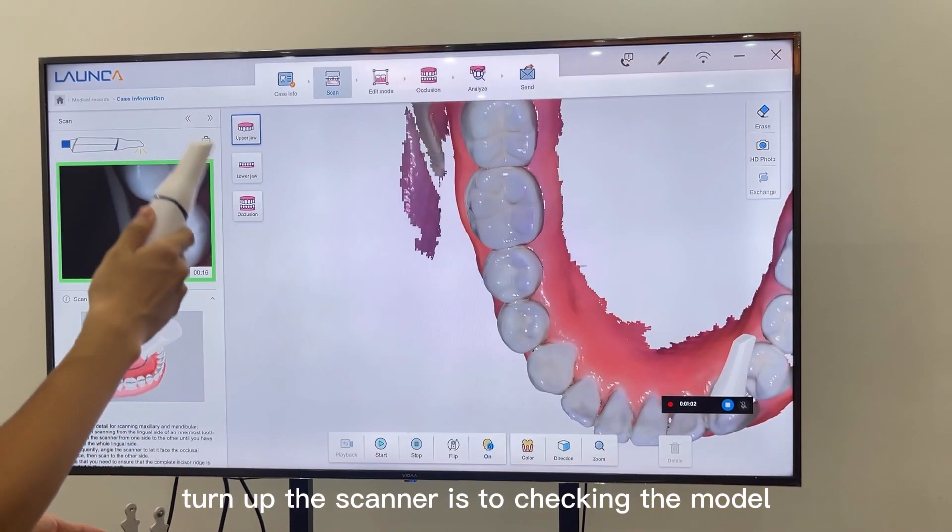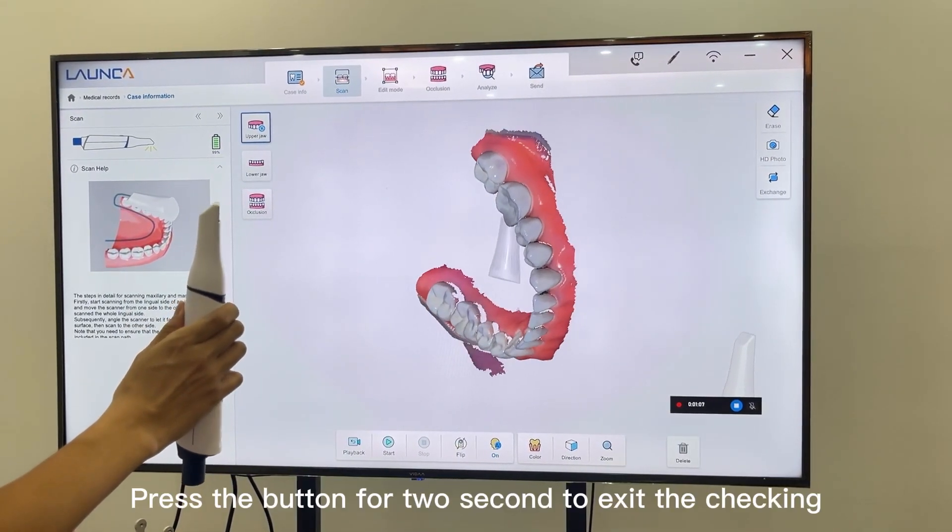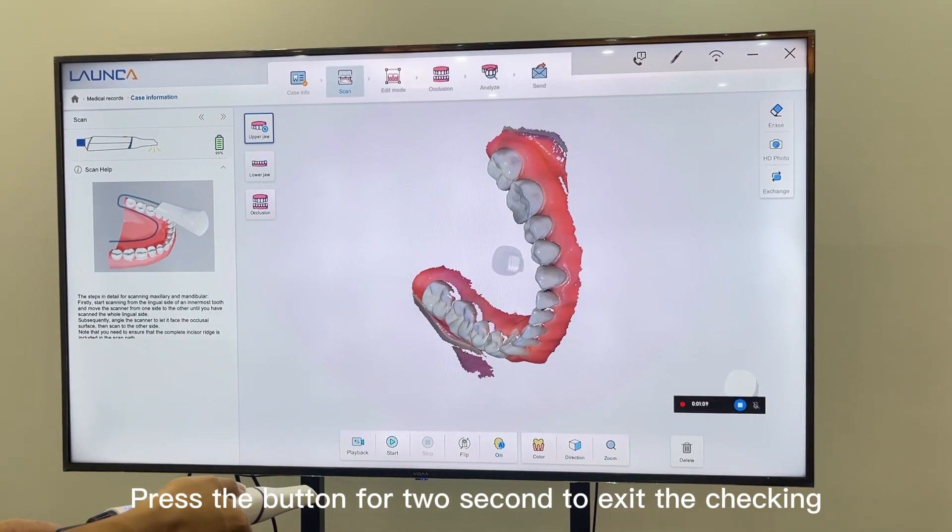Turning up the scanner is for checking the model. You can change different directions and angles to rotate the model. Press the button for two seconds to exit the checking.